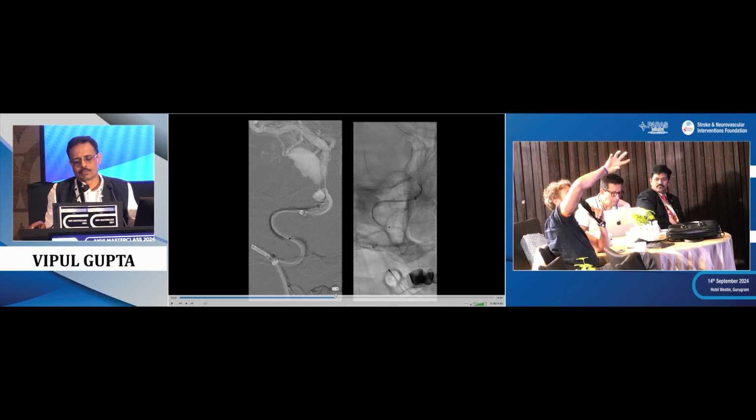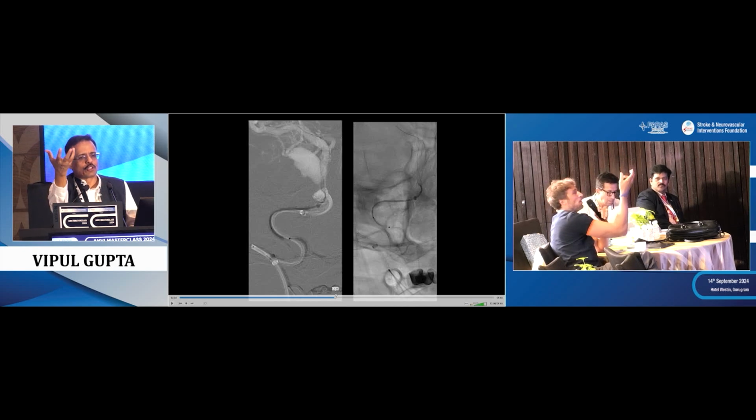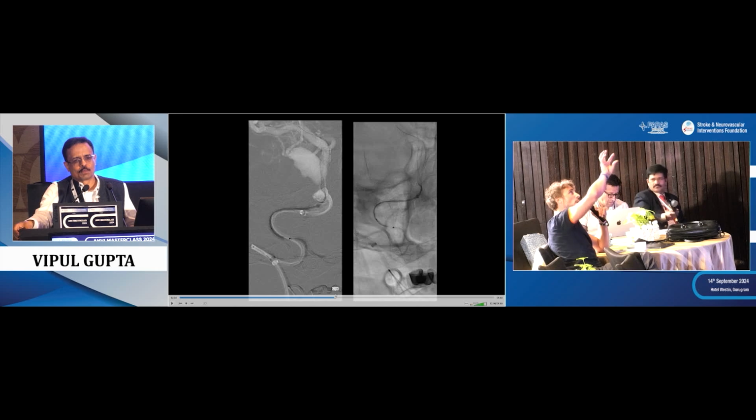But the catheter, when you unsheath, is not unsheathing like that. It is unsheathing like that because it wants to come back to its normal trajectory. But here, you are transmitting the rotation to the stent. So the stent is rotating with the restitution of the microcatheter, and then is twisting. So that's normal, that's an obligation to see this.